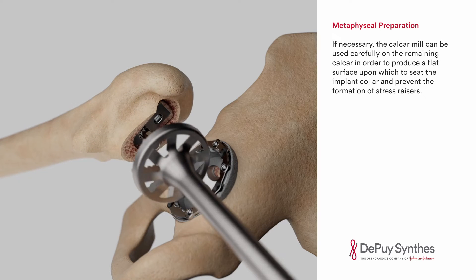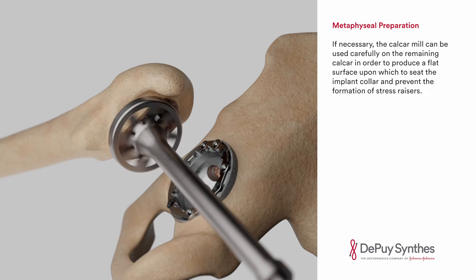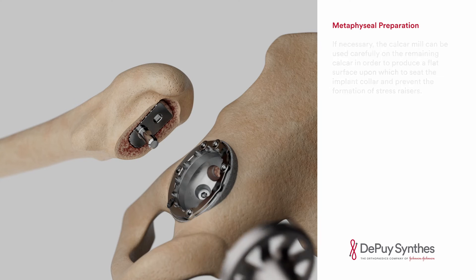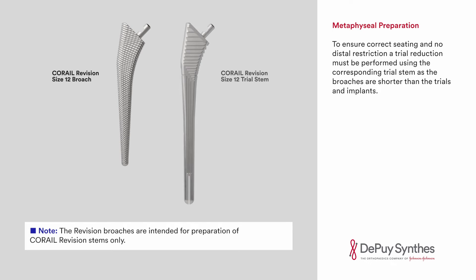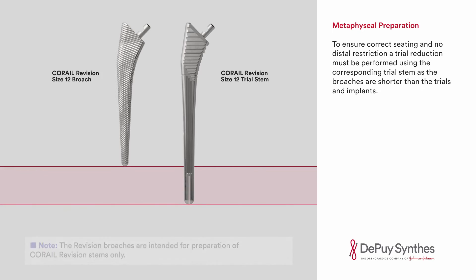If necessary, the calcar mill can be used carefully on the remaining calcar in order to produce a flat surface upon which to seat the implant collar and prevent the formation of stress raisers. To ensure correct seating and no distal restriction, a trial reduction must be performed using the corresponding trial stem, as the broaches are shorter than the trials and implants.